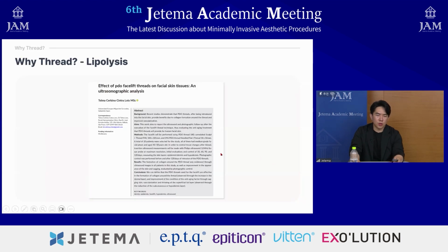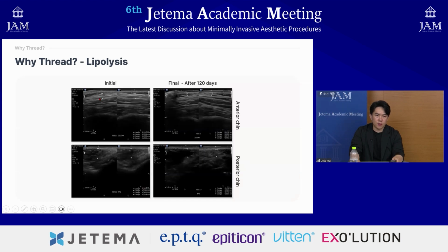And also, I told you that there will be a little bit of protrusion of fat after the skin ages. And PDO also has the effect of decreasing the fat layer. So when you insert the thread in the fat layer, you can see that the fat layer is this much. This is the subcutaneous fat. And after 120 days, the subcutaneous fat layer has decreased. Here you can see that there's a thread, and this is the subcu fat, which will be decreased after 120 days.